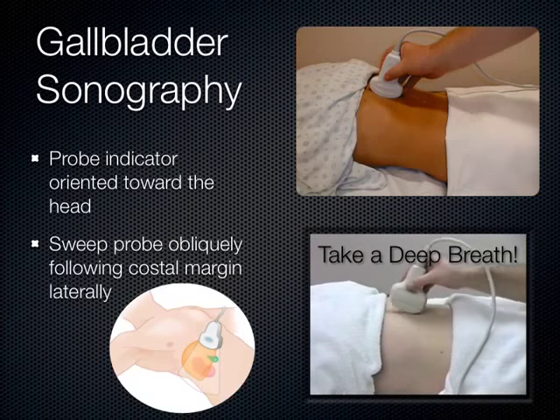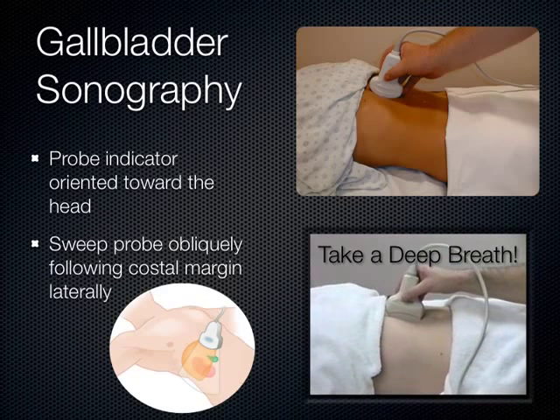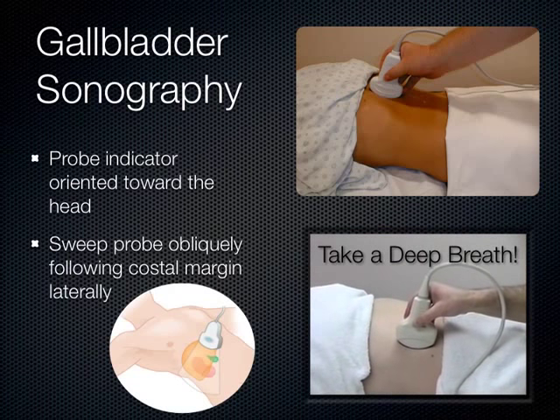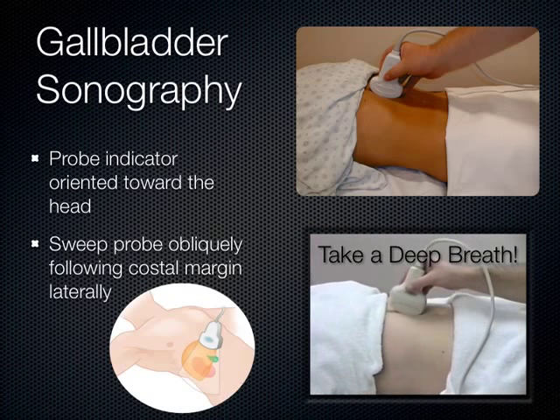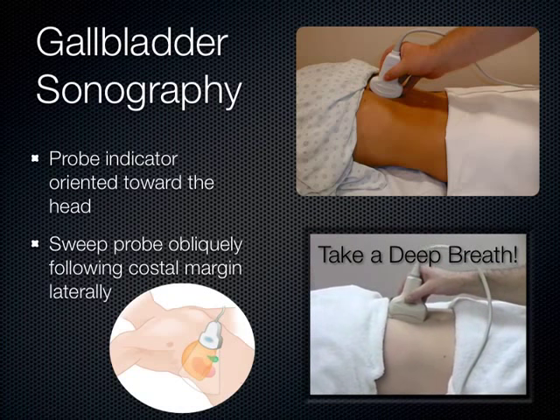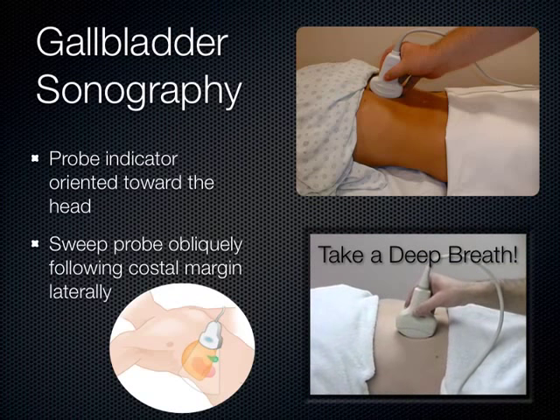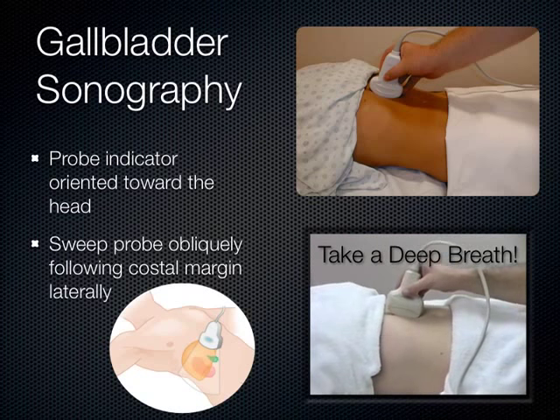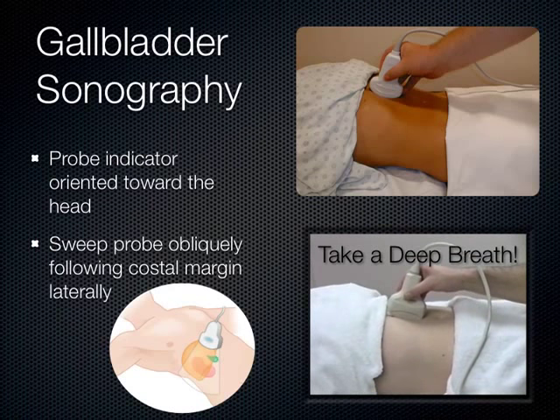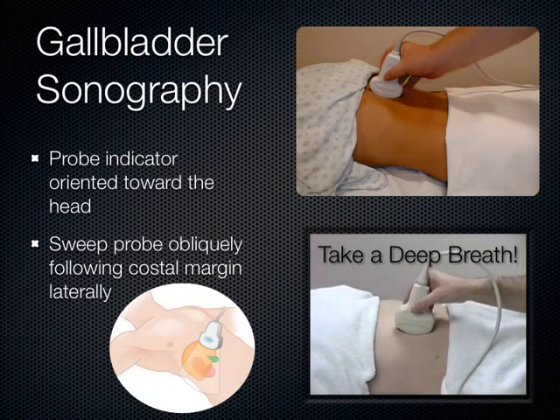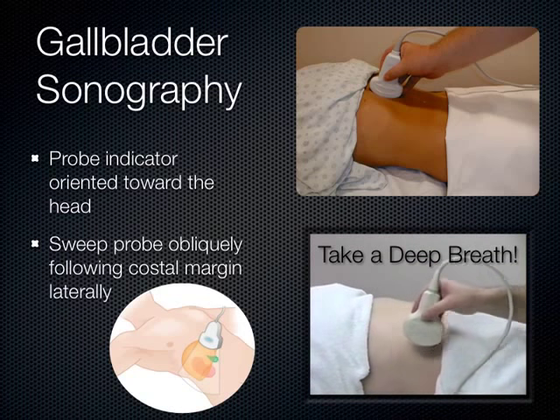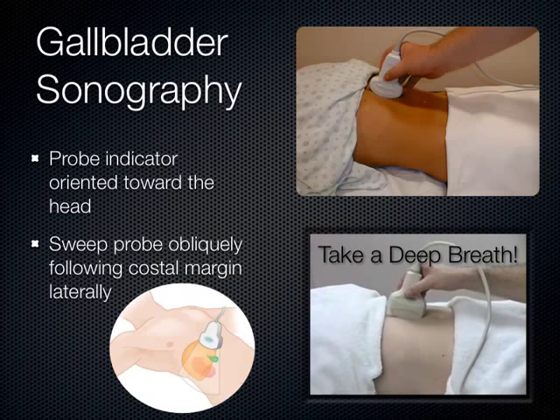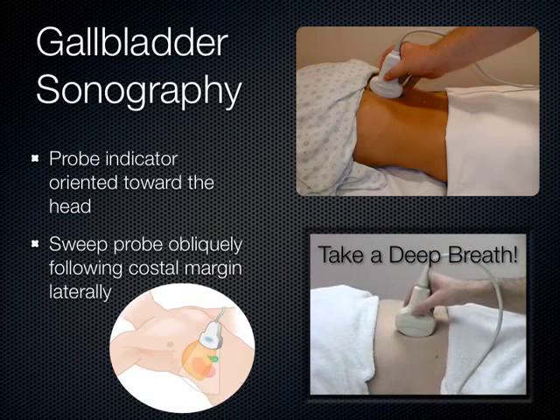Moving on to the gallbladder. This is gallbladder ultrasonography 101. You do a subcostal sweep where you take the indicator and aim it towards the patient's head, have the patient take a deep breath, and follow along the costal margin. The patient takes a deep breath and you slide right along that inferior costal margin. There are so many anechoic structures that sometimes you need a landmark to help identify the gallbladder.